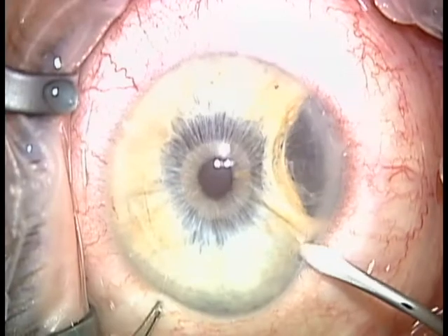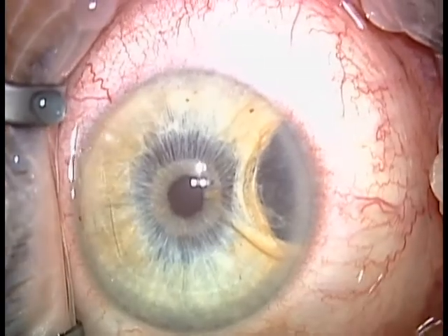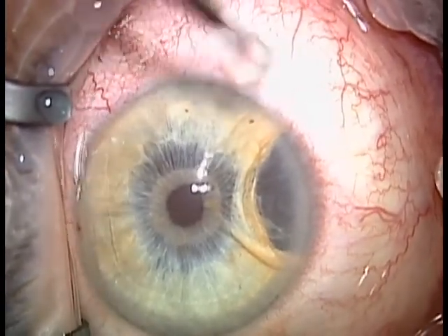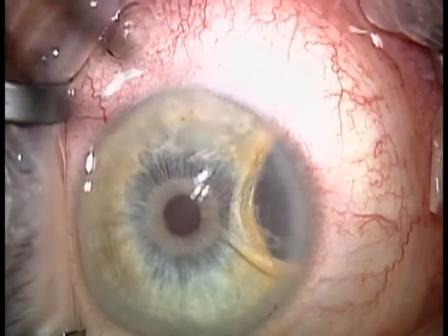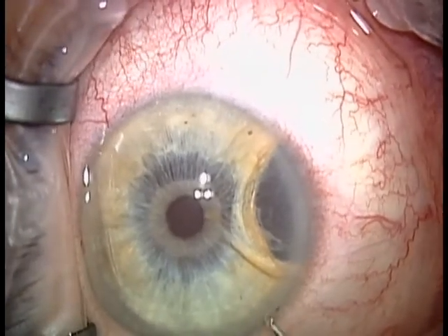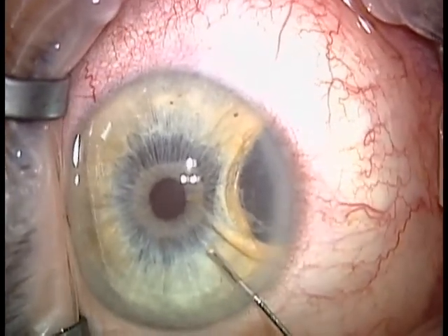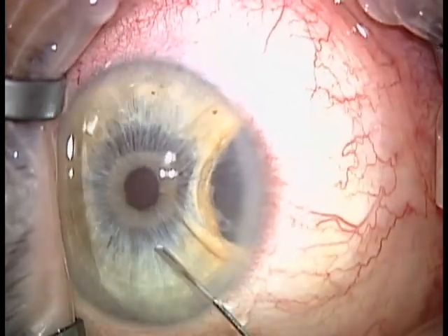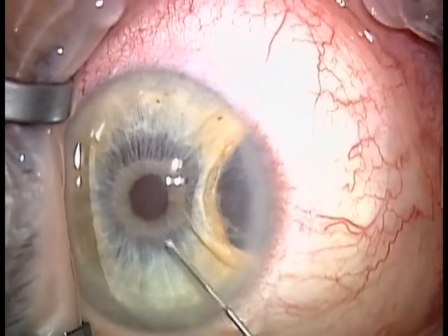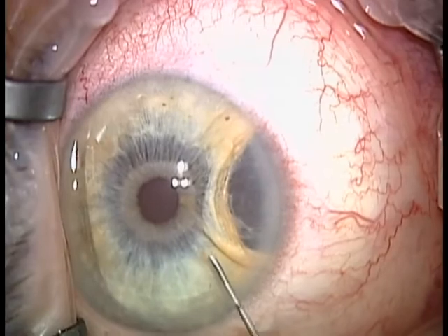The first step is to make paracenteses. Irrigate the anterior chamber with 1% non-preserved xylocaine. Then wall off the cyst both anteriorly and posteriorly to the iris with viscoelastic, so that in the event the cyst bursts or you have a leak, you can contain the alcohol.